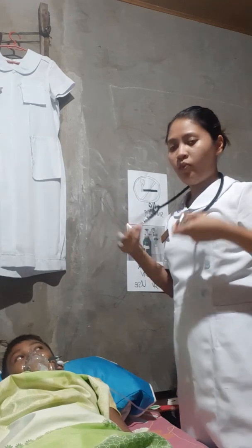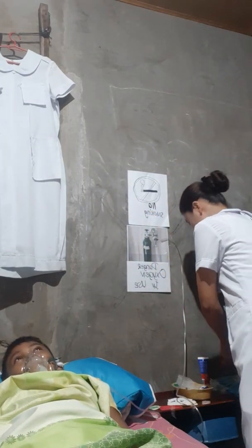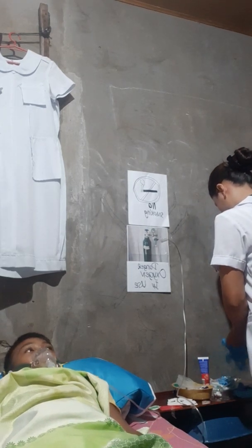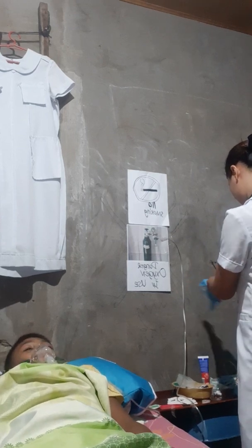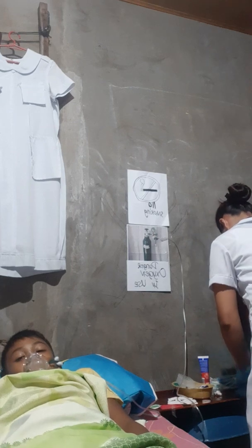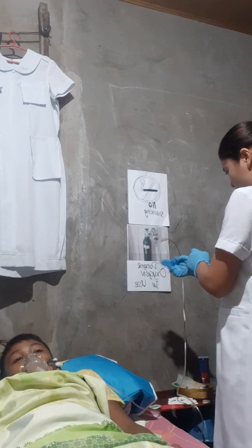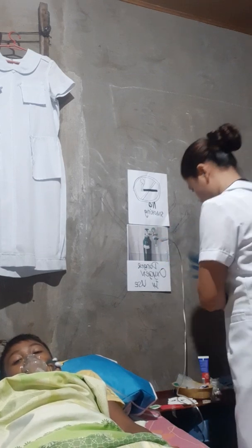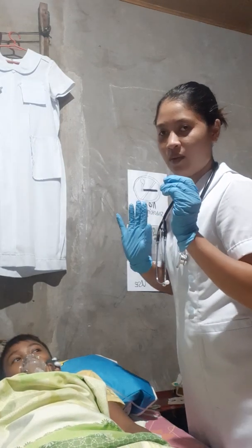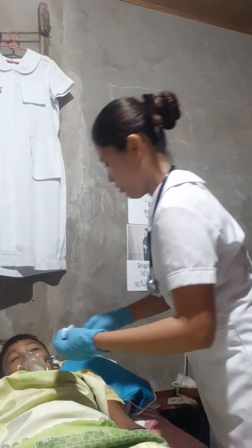Afterwards, remove PPE if used and perform hand hygiene. After performing hand hygiene, put on gloves. After gloving, remove and clean the face mask.